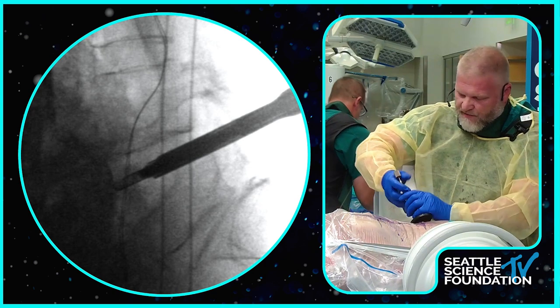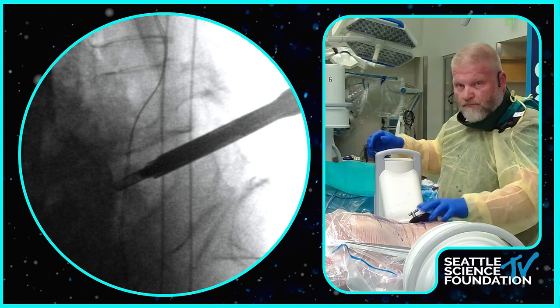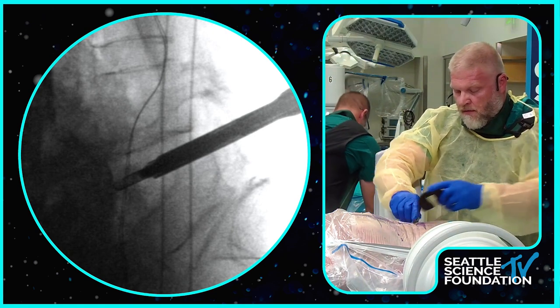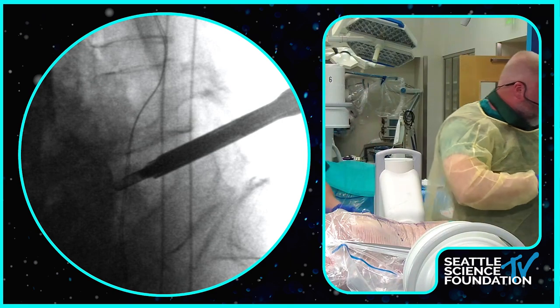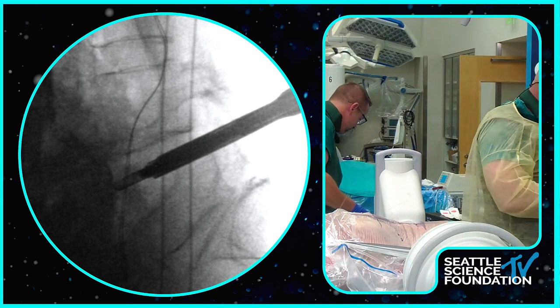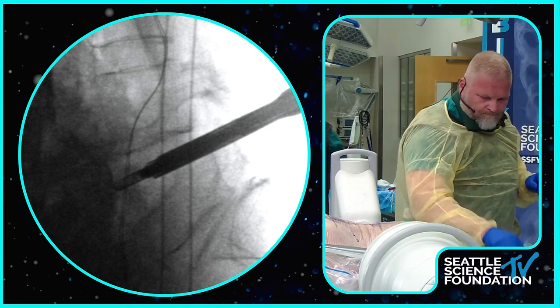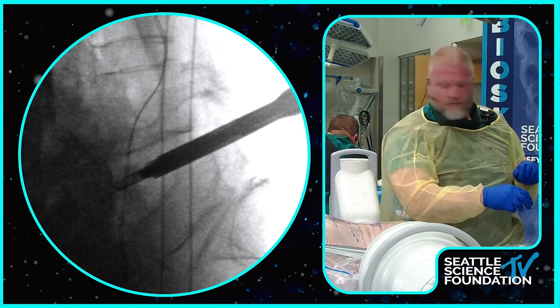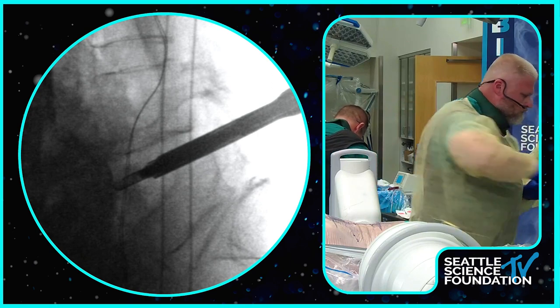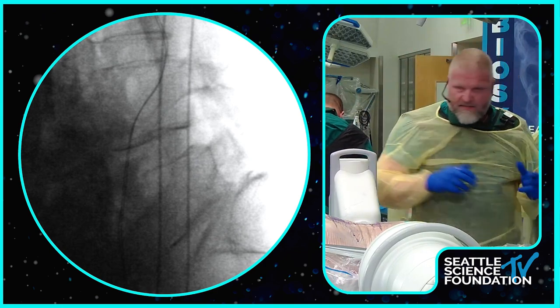So we'll fill it up, pull it out. There you go. And this is not going to look very good because we didn't clean the disc. You're doing a very good disc. Okay. Stay tuned. You guys want to look in there and see what it looks like, or a one-step dilator? Can we get a lateral x-ray to see the final expansion? I think you put all the bone graft in there, correct? You can't see it. Okay. It didn't expand because I didn't have the disc cleared out.